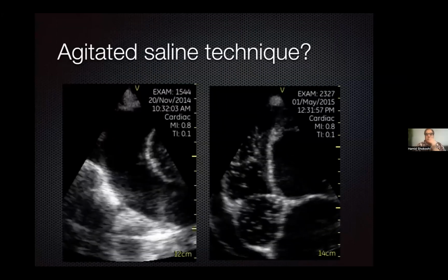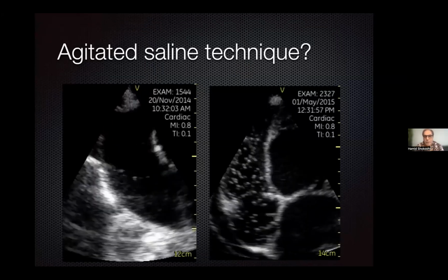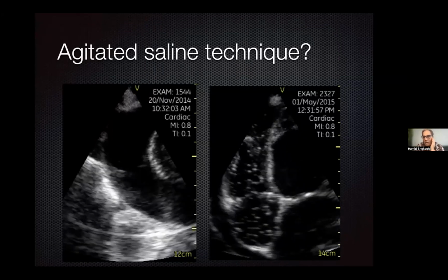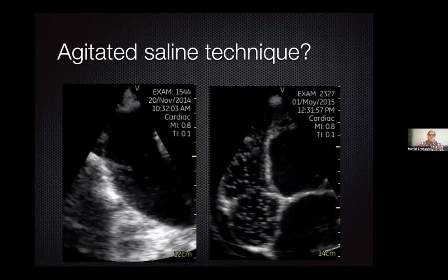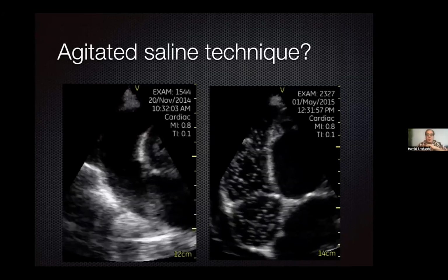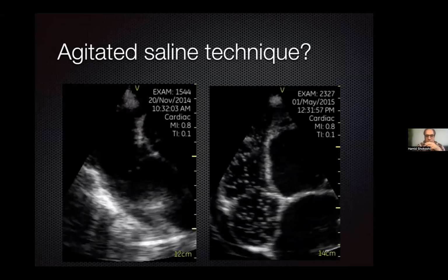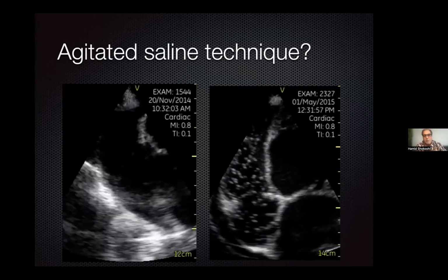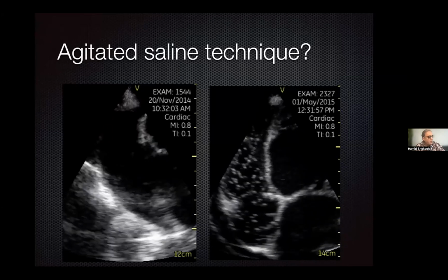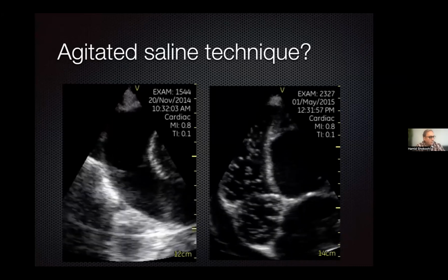And one thing we did in this one, that later on I used a lot, is confirmation that the catheter is actually inside the pericardium. When we go in, it's very hard sometimes to identify the path of the needle because you have the probe in here and the needle is going right parallel to it. So you are not catching the tip of the needle, just the shaft of the needle. When you are going in the right direction, as soon as you get into the actual pericardium, you can inject a little bit of saline, and that causes agitation in the pericardium.